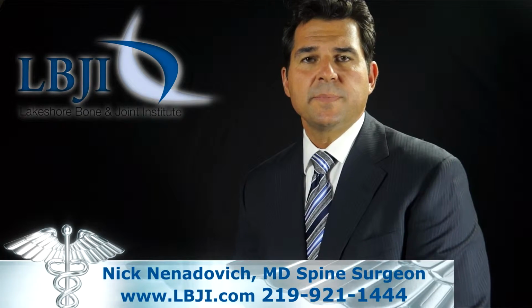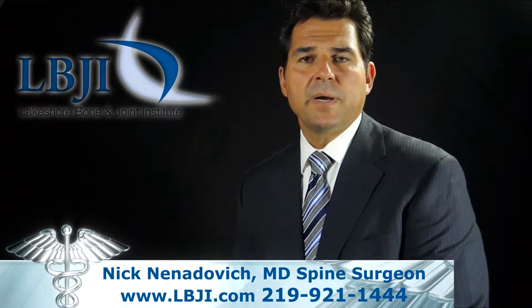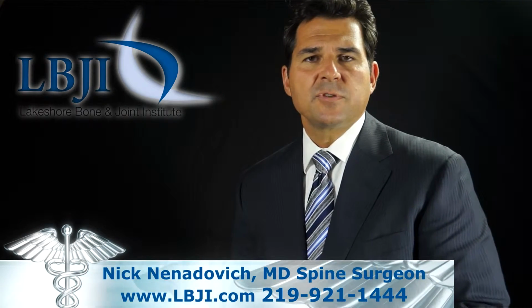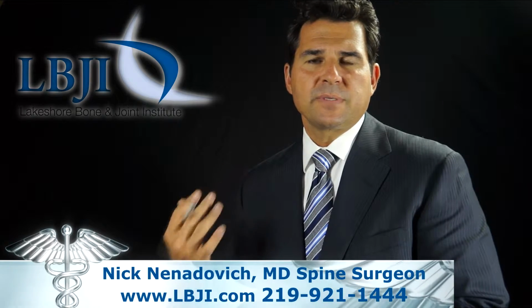One of the latest advancements in spinal surgery has been the advent of the artificial disc for the cervical and lumbar spine. The cervical spine has actually had more utility associated with an artificial disc as opposed to the lumbar spine due to less load-bearing characteristics and requirements of the cervical spine compared to the lumbar spine.